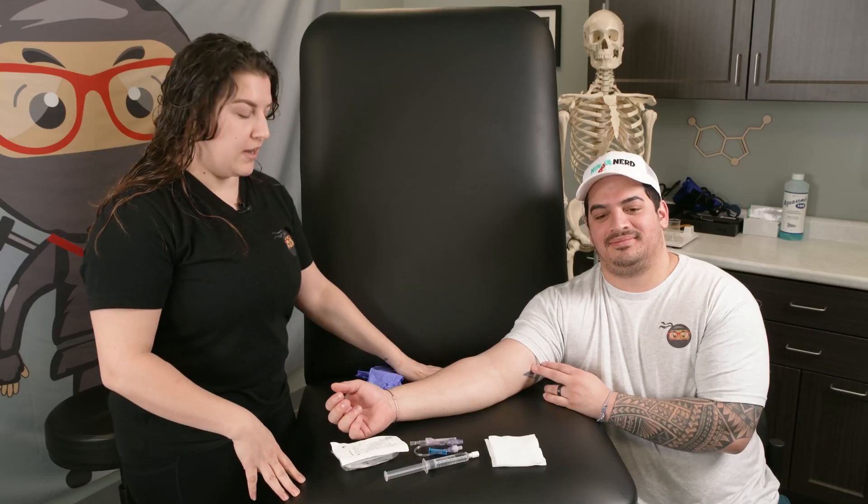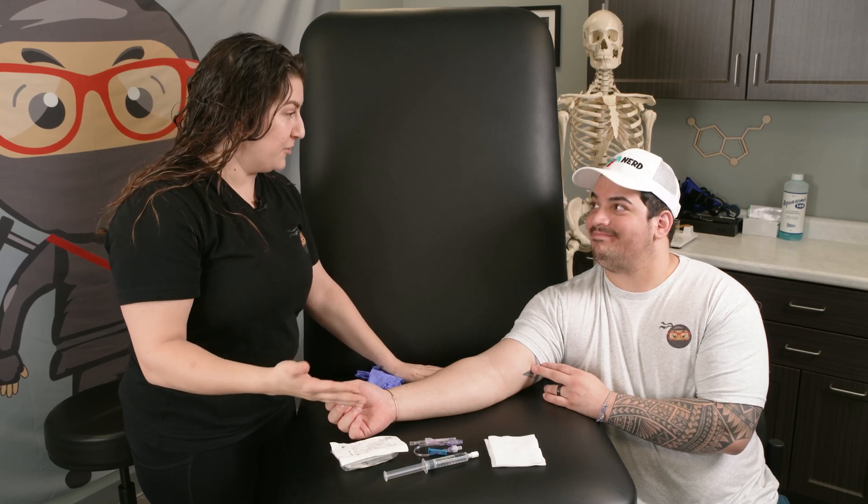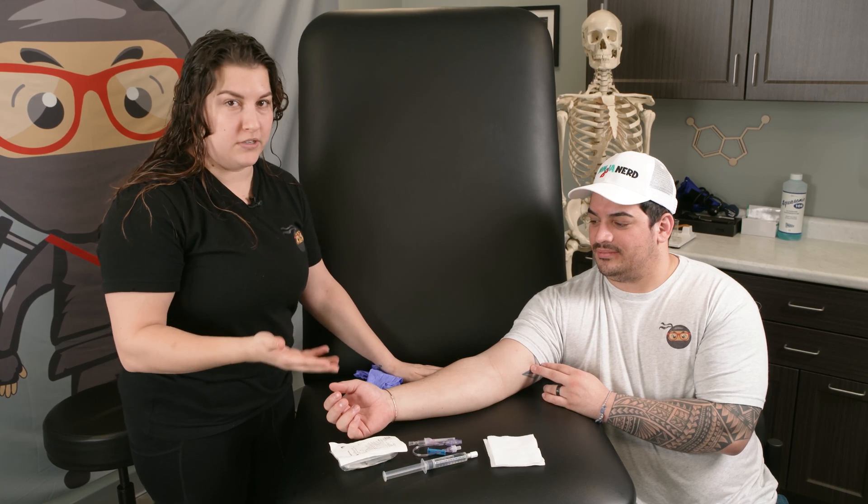Hi Ninja Nerds, in this video we're going to show you how to start an IV. I have Zach here as my patient — he's going to let me put an IV in his arm. Don't worry, he's going to get me back in another video. So let's get started. The first thing we're going to do is tell our patient who we are. Hi Zach, I'm going to be your nurse today. My name's Kristen.